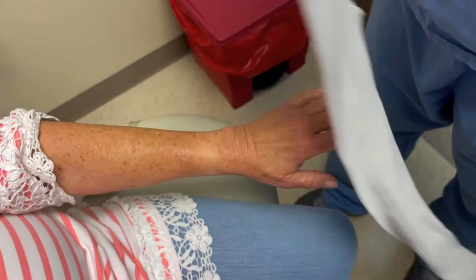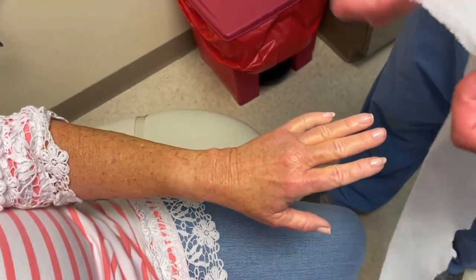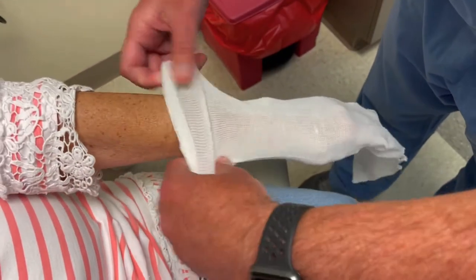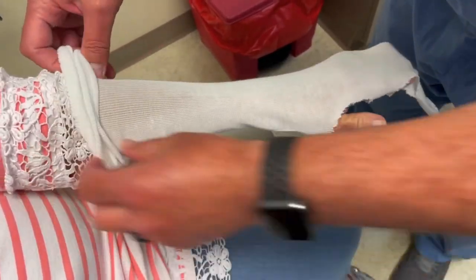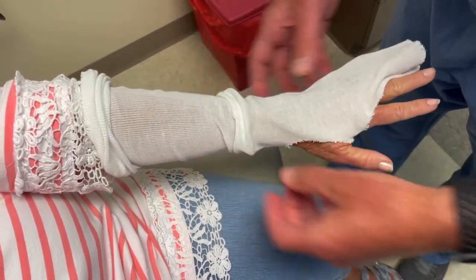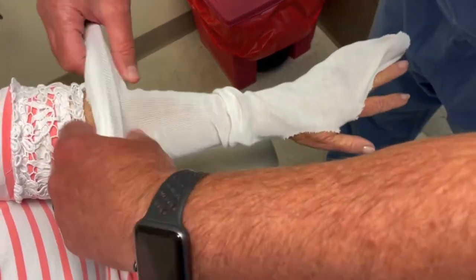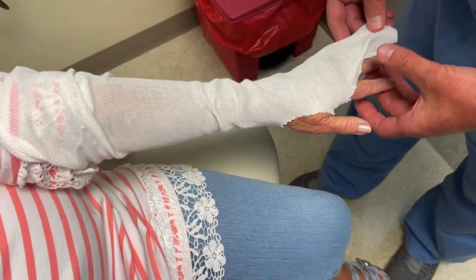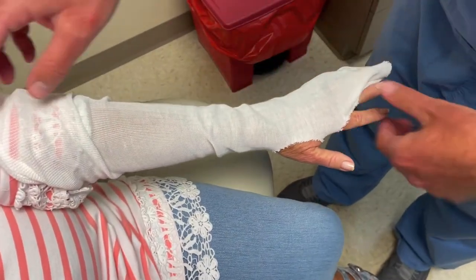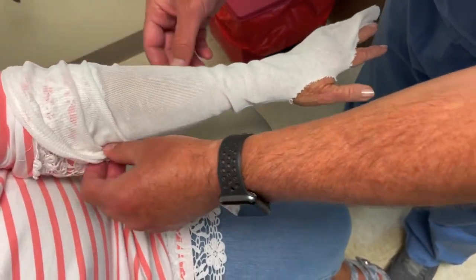I've already pre-cut this for an ulnar gutter splint. What we're gonna do is pull this up on her — your thumb is gonna go through that hole and then these two fingers are gonna go through there. So there's your ulnar gutter. We're gonna wrap these fingers up because she broke this bone. Make sure when you're doing this give yourself plenty of length — you can see how long that is — because you're gonna fold this down. That's a little bit long but that's okay, you just don't want to be short.